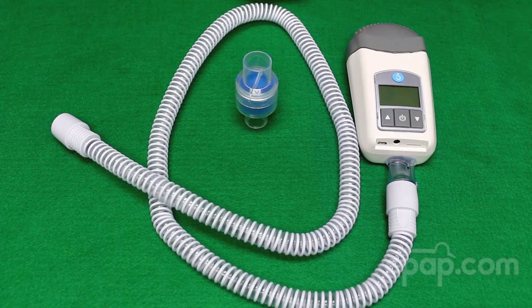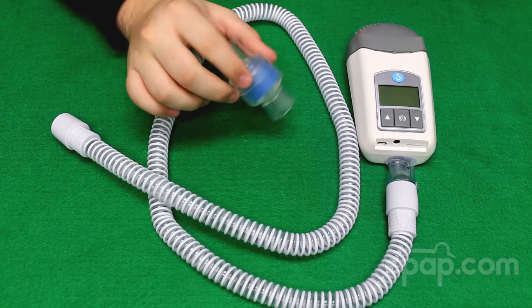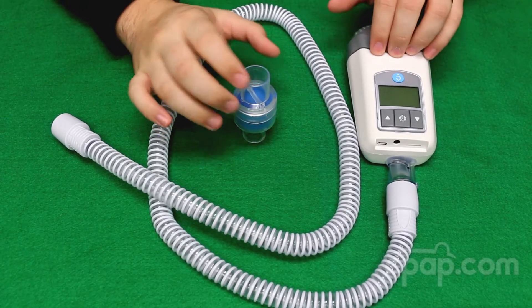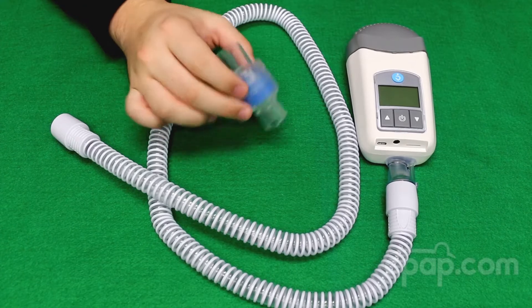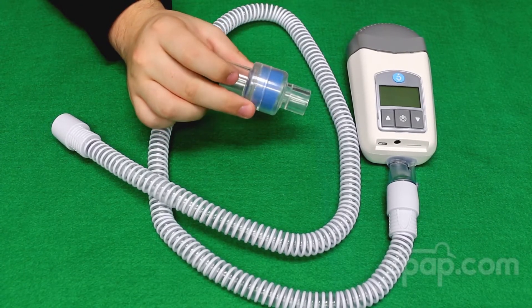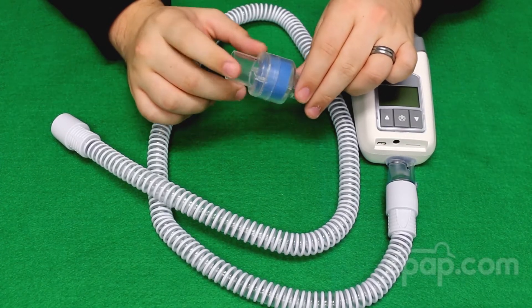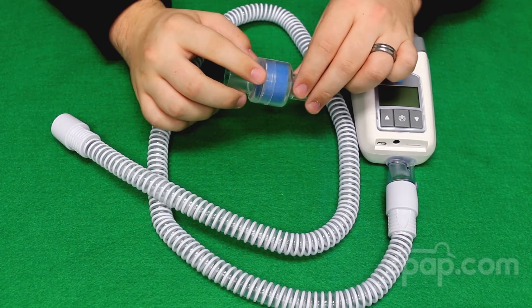Chris and Bonnie here with CPAP.com to describe the Heat Moisture Exchange Unit, or HME, that is included with the Z1 Travel CPAP machine. This HME is designed to be used in place of a traditional humidifier, and it collects moisture from a person's breath and recycles that back to them on inhalation so that they have moisture with their therapy.